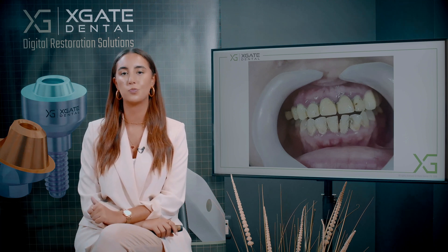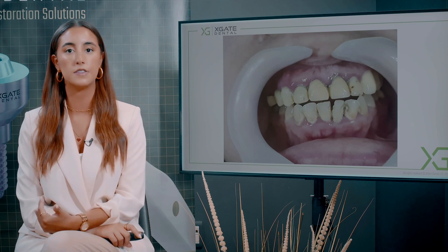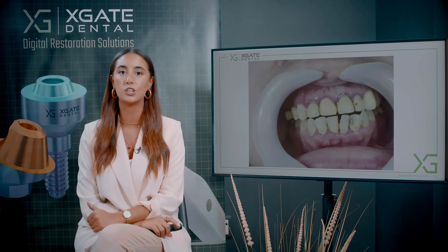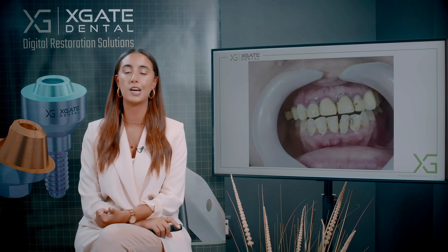Today we have a case where we'll show you a screw retained restoration bridge on the upper jaw. We'll extract some of the teeth and then we'll have a temporary bridge on the teeth that we left, and later on we'll change the provisional bridge to a zirconia bridge on top of those implants.